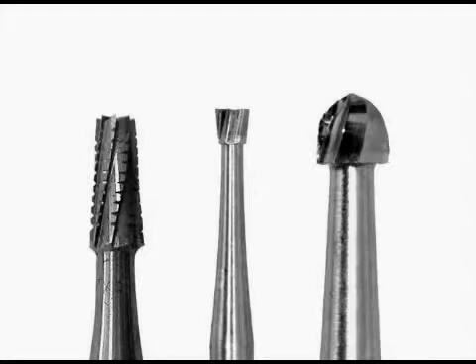Midmark recommends using carbide burrs only once, as they are never as sharp after the first use. Using a dull burr means that each additional procedure will take longer, and the operator may be tempted to apply too much pressure during use. This would reduce the life of the handpiece turbine. Regardless, burrs should always be removed after use to allow for proper cleaning of the handpiece.